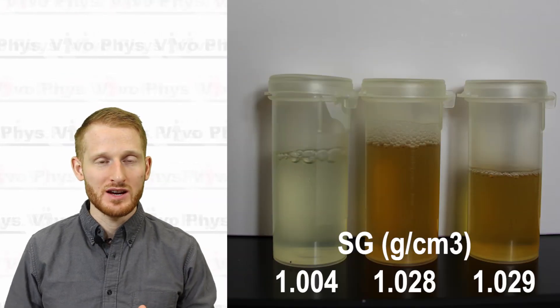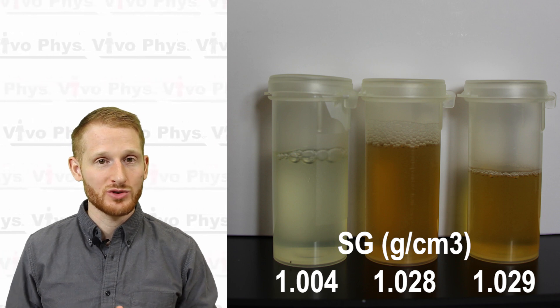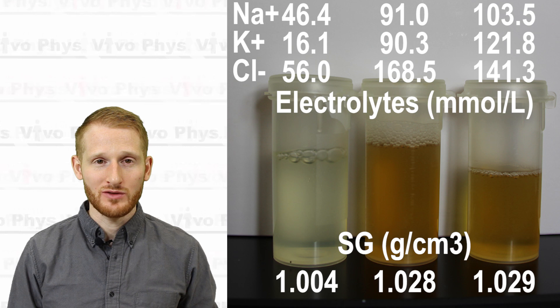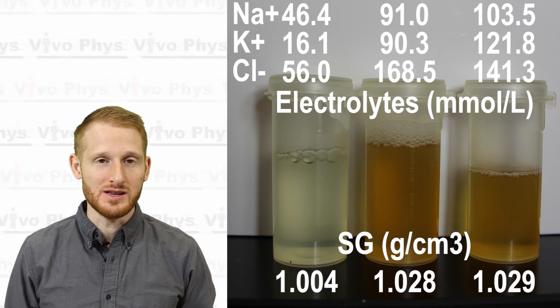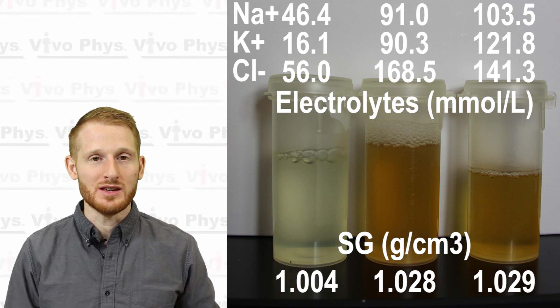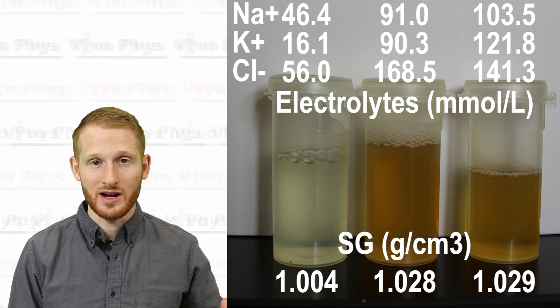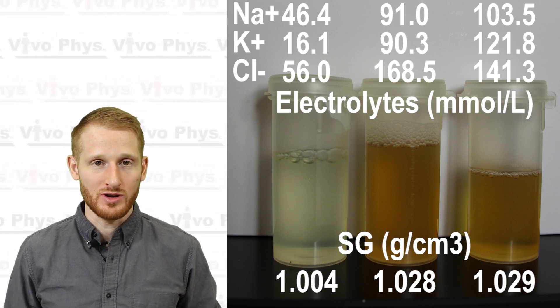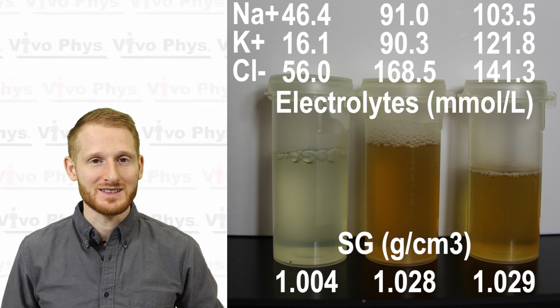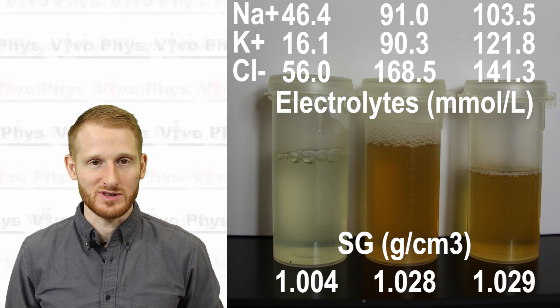Urine specific gravity is really good for assessing hydration status. Typically any value above 1.020 is considered dehydrated. You can see here that I ran three different urine samples, two of which were dehydrated and one of which was well hydrated. The sodium levels within these samples matched up with the specific gravity measurement — the dehydrated samples had higher sodium levels, while the normal or even hyperhydrated sample had lower sodium levels. Sodium and other electrolytes in the urine make up a lot of what affects its specific gravity.